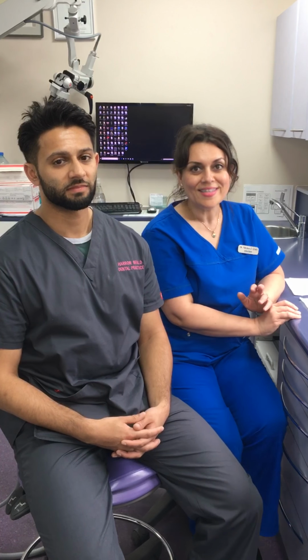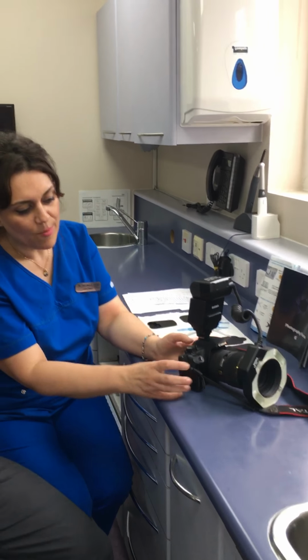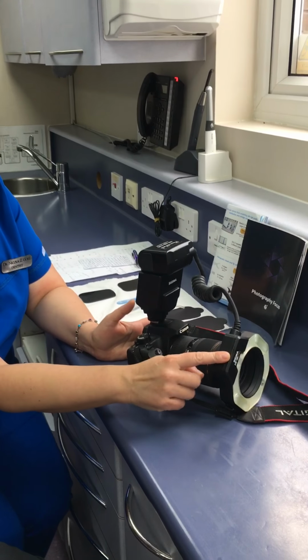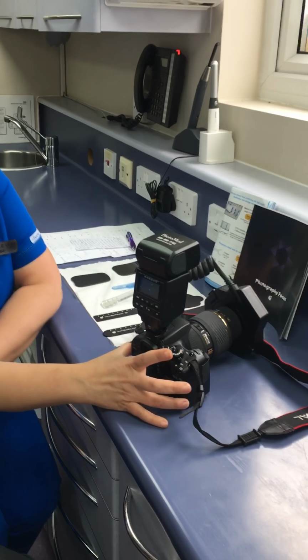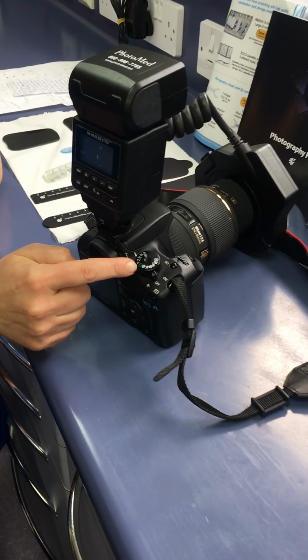So thank you, Ian. So Nikhil, this is the camera. The camera has got a body, it's got a lens, and it's got a ring flash. On the body of the camera, you find a knob. The knob will have all these little letters on it.